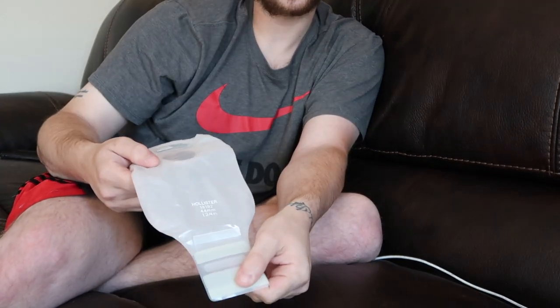Alright, so as Lexi was talking earlier about his ostomy bag, we're just going to show you how it works. Of course, this connects to his bandage on his stomach. This end is how we drain it, but as you can see, it's just a spout. So when it's on him, you roll it up, and it has this nice little Velcro piece, and you can hear it lock into place. So that is closed. And then when we vent him, you just lift this up, unfold it, and of course drain it into a poop pan.